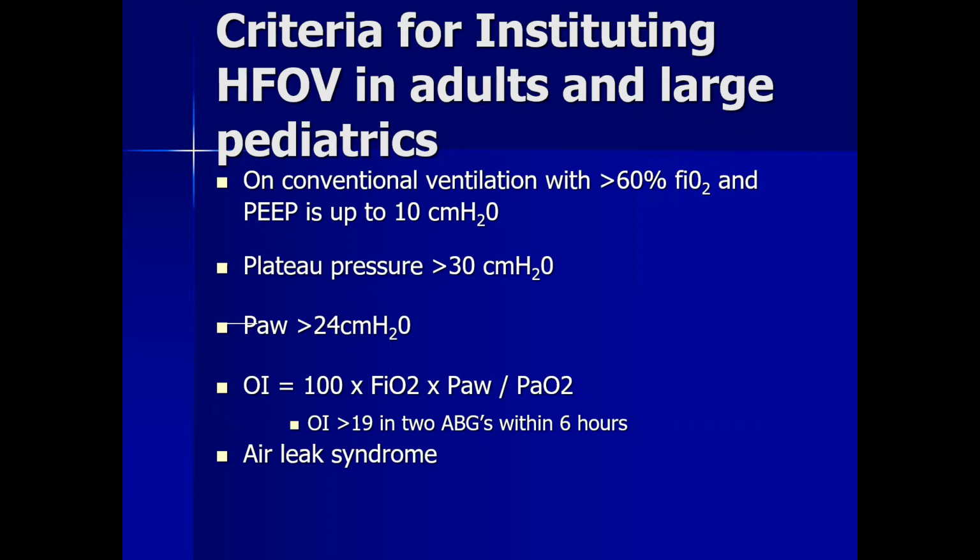So high mean airway pressure is another indication. High oxygenation index greater than 19, that's another indication. Air leak syndrome is an indication for using oscillation. I have a video coming up a little bit later.